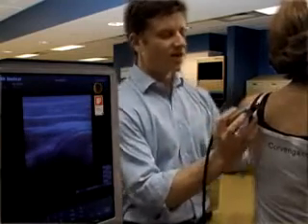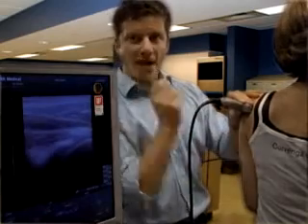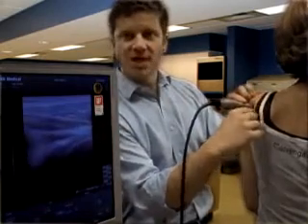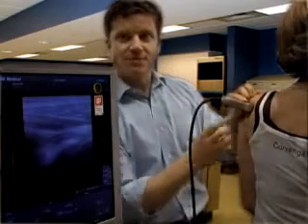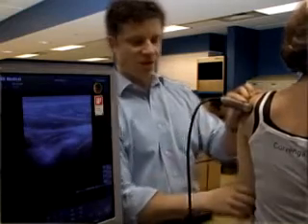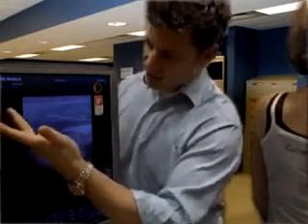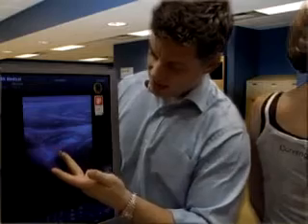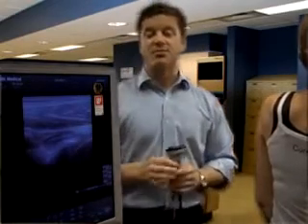The other technique you can use is a medial injection approach. That is, capturing the same view — which doesn't differ from the other one — and taking your needle from the medial side, coming in this way and traveling lateral. With this technique, the patient can be in a normal sitting position, comfortable, and your needle will travel across and go right next to the glenoid or over the top of the humeral head, injecting from that approach as well.